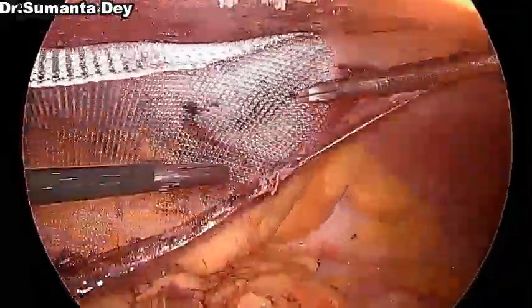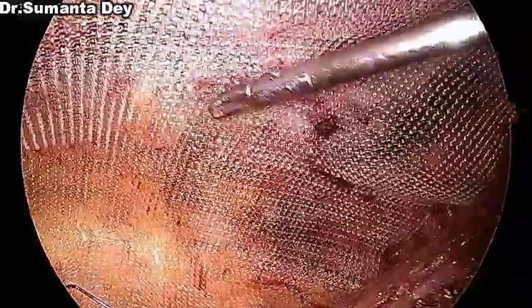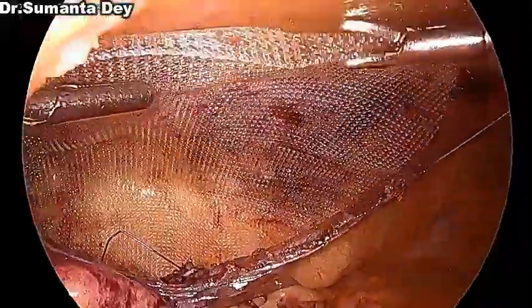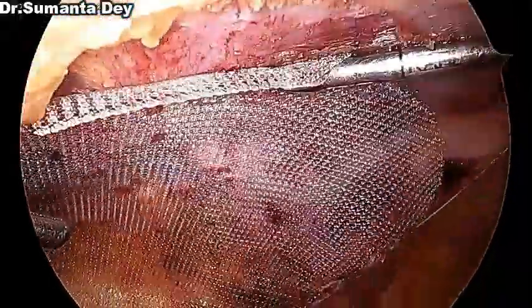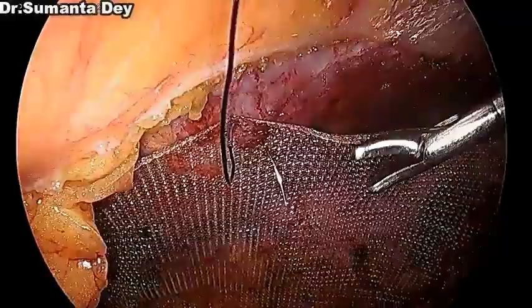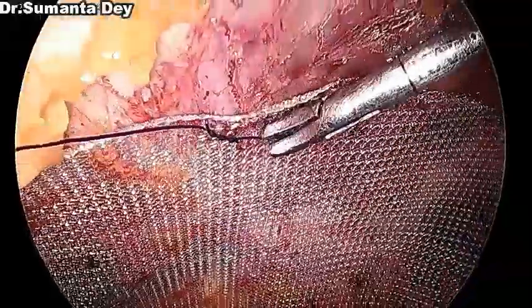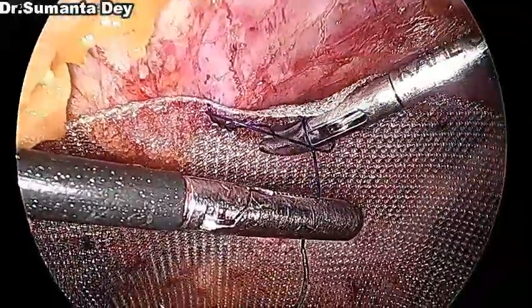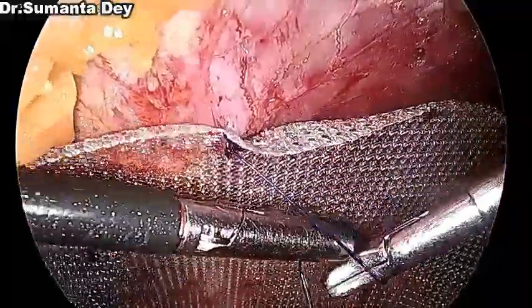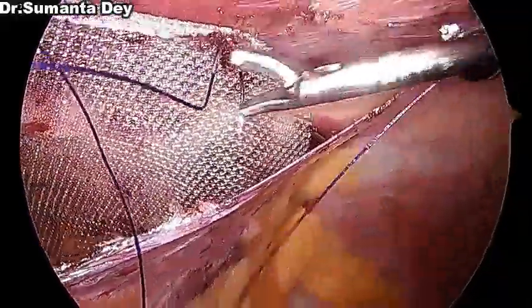If you have done enough dissection, you can very easily adjust one large mesh, 15 by 15 centimeters, with at least 5 to 6 centimeter coverage all around the defect. You can see the mesh is nicely sitting without any undue folding, and that should be the ideal closure. Now I'm fixing the mesh with the same 2-0 PDS suture. I'll do 4 to 5 point fixation, on the proximal margin, and another point of fixation with the posterior rectus sheath.